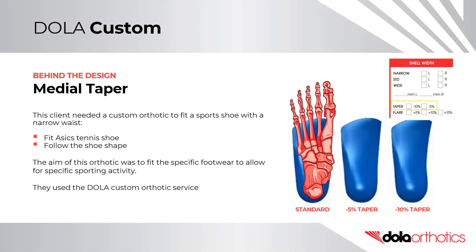Behind the design: medial taper. This client needed a custom orthotic to fit a sport shoe with a narrow waist. It is designed to fit the ASICS tennis shoe and follow the shoe shape. The aim of this orthotic was to fit the specific footwear to allow for a specific sporting activity.